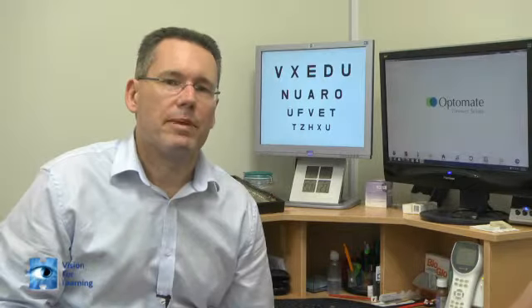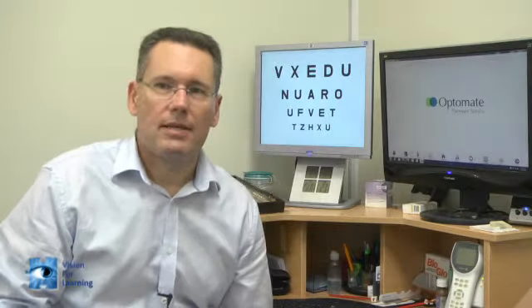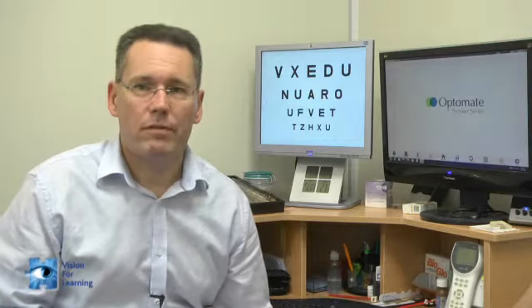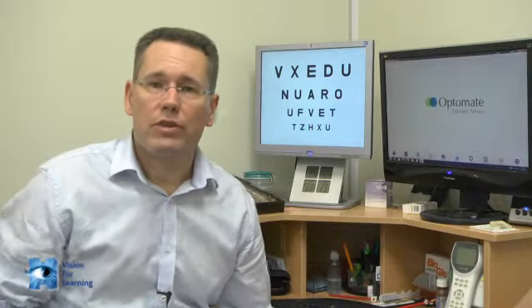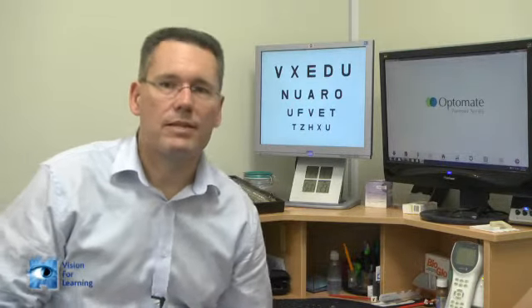I'd like to briefly chat about referral and treatment. When it comes to referral, we offer a simple tick box referral form that goes to the optometrist. These are included in the 3-point check test kit, but copies of the form can be downloaded from my website.